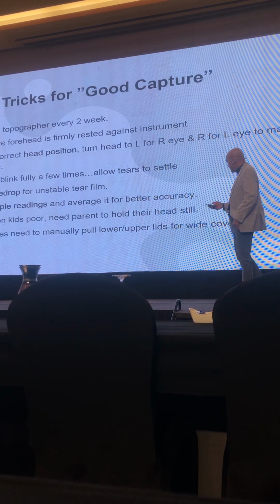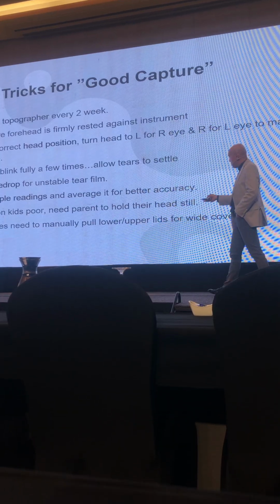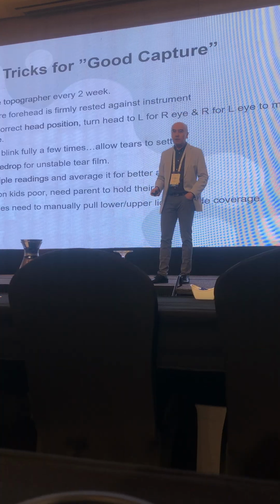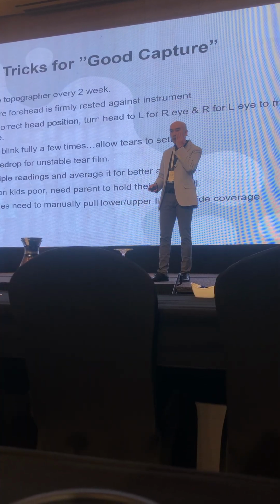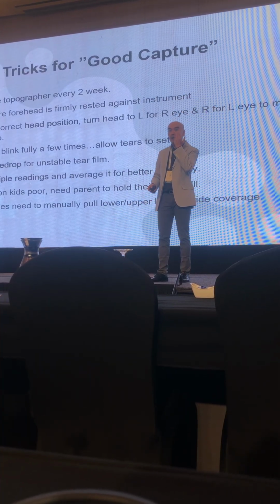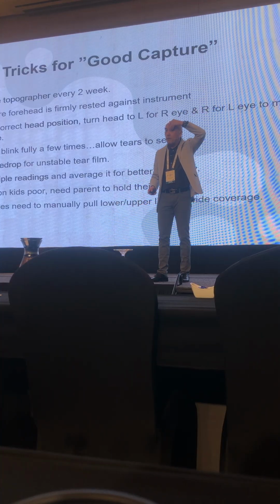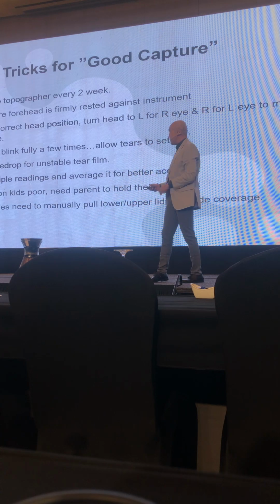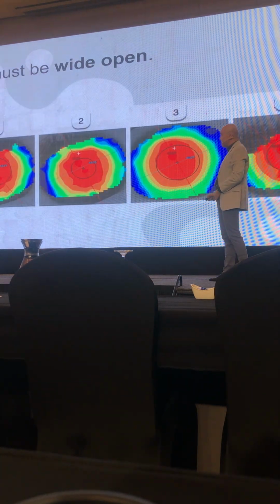Now, sometimes some people will have a smaller lid aperture. Then you may need to slowly pull the lower lid while you pull the upper lid. Ask them to have a few blinks and capture the image. Any more extra tips?